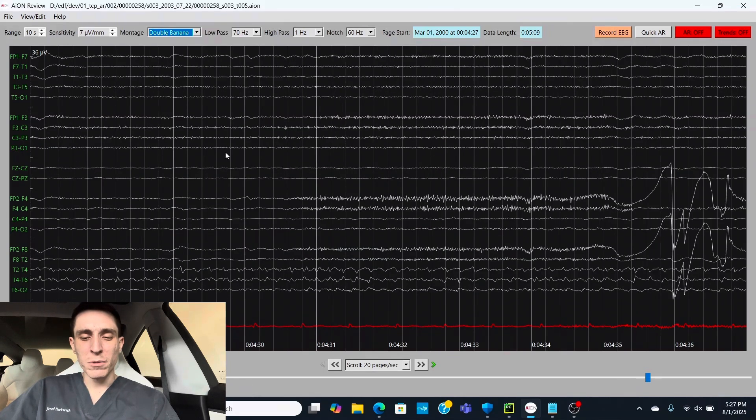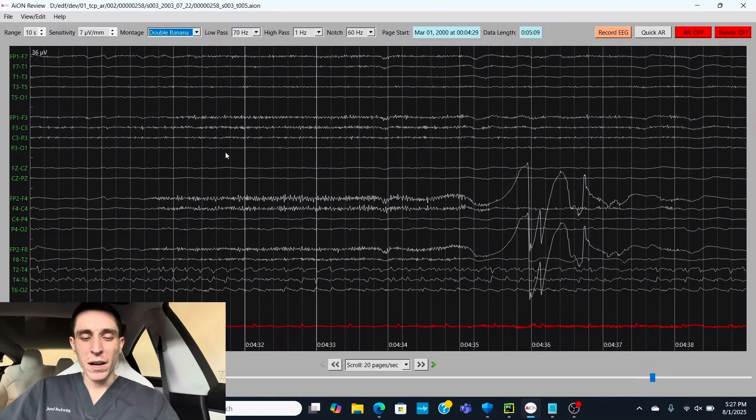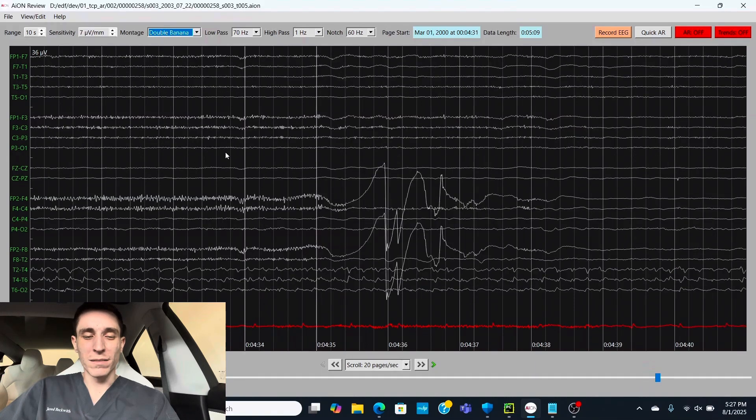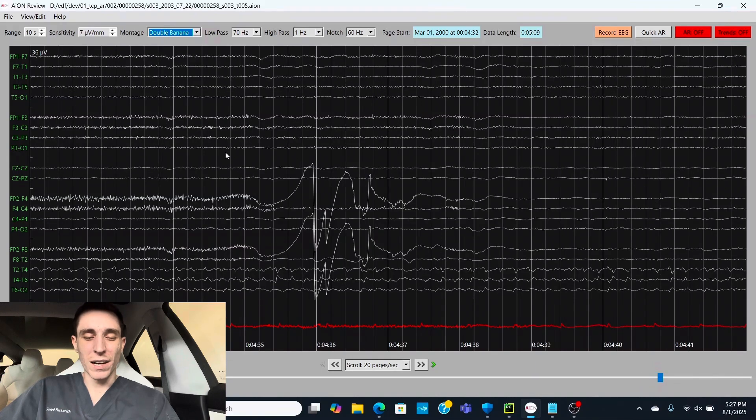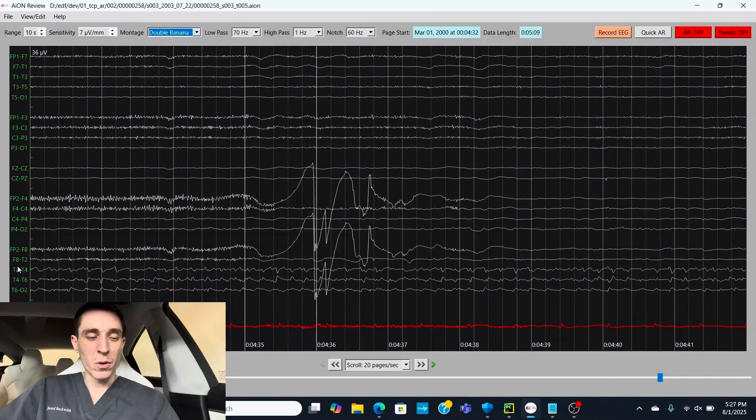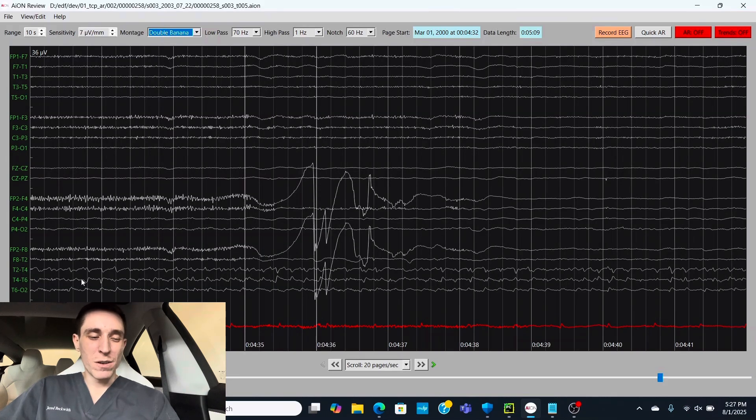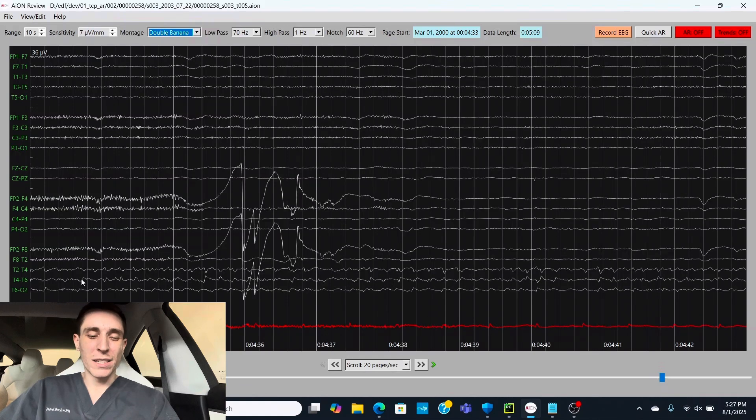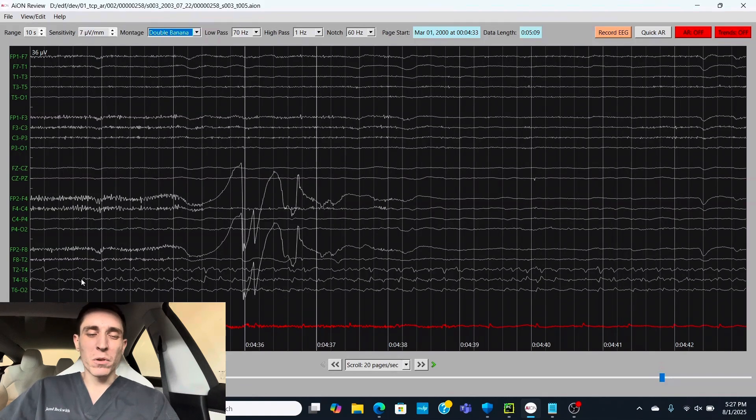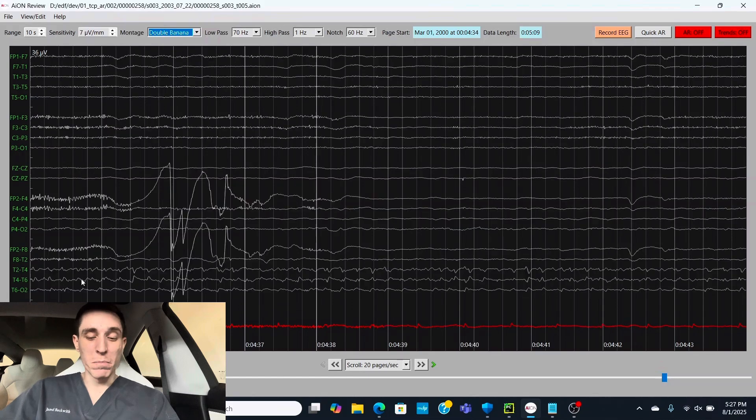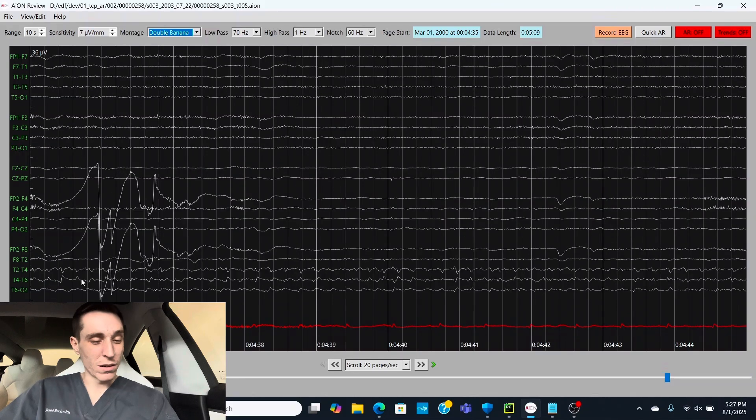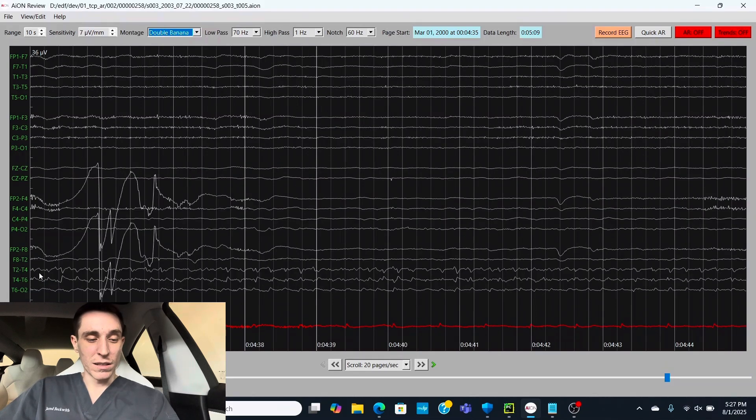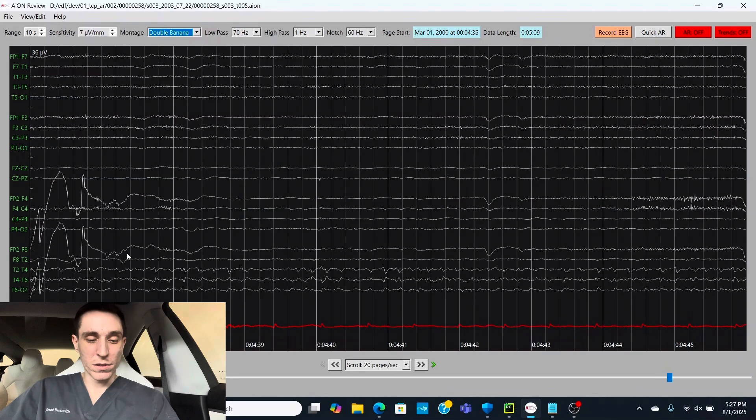Pretty cool. That's a lot of what EEG is about. It's about comparing the left and the right sides of the brain. It's good we hook up the whole brain, in this case, even T1 and T2. I like those extra electrodes, T1 and T2, because it allows you to get more of the temporal lobe recorded. And that's where many seizures are found. And in this case, this is probably where the tumor is.